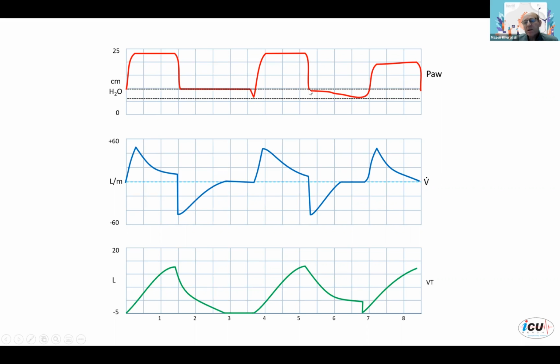If you have a PEEP in the system, and this is a PEEP of, I see here, 10, okay? And this is a breath without air leak. You can see here the volume returning to 0. You can see the inspiratory volume is similar to the expiratory volume. Compared to this one here, it's initiated by the patient, and the line here that we have is the trigger line. This is how much pressure the patient needs to develop in order to trigger the ventilator, how much negative pressure the patient needs to develop. And this is triggered by the patient.